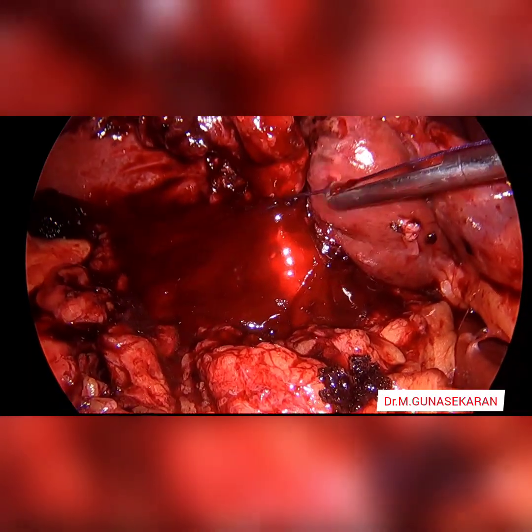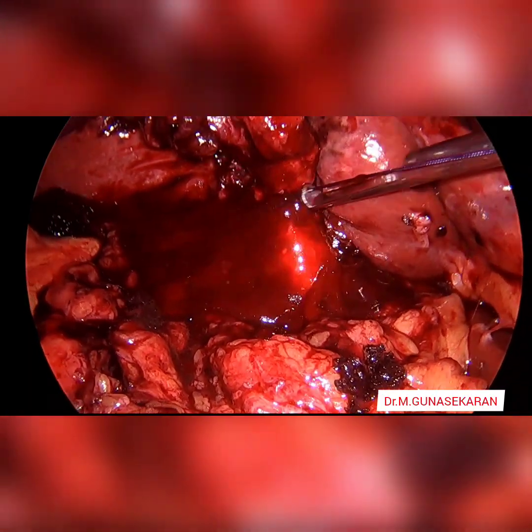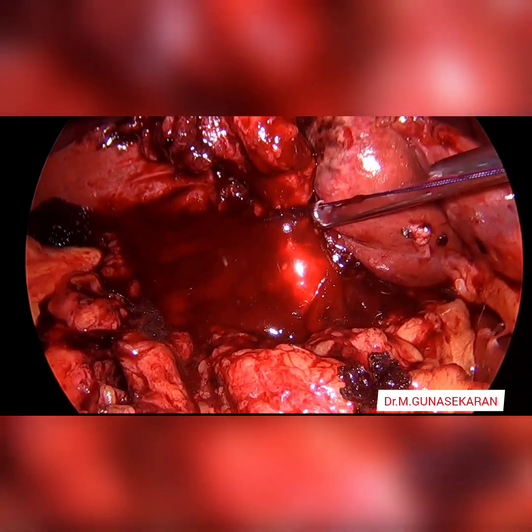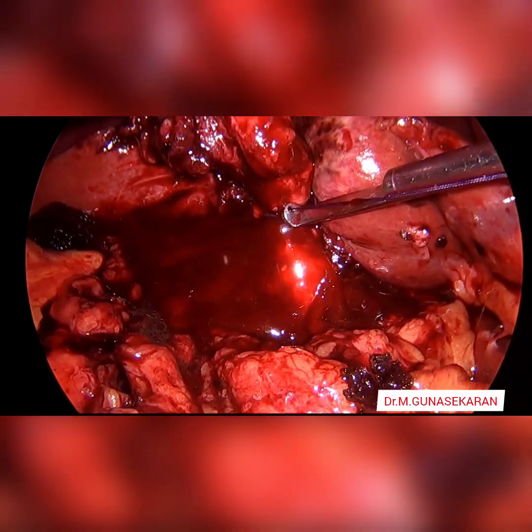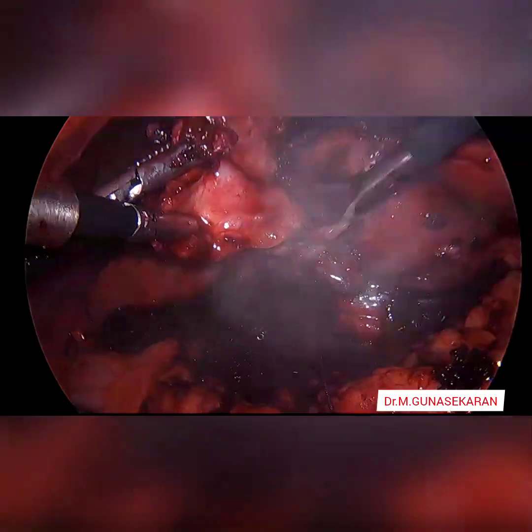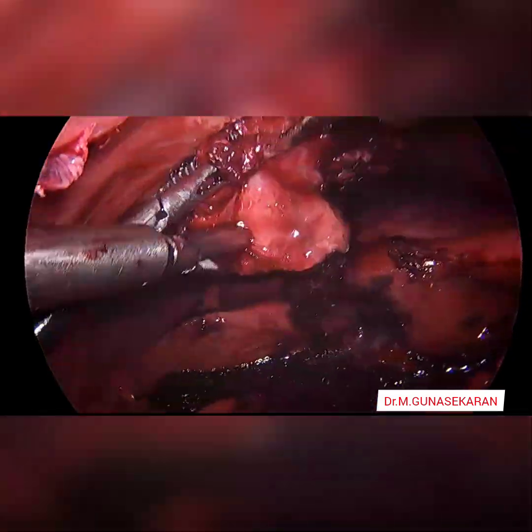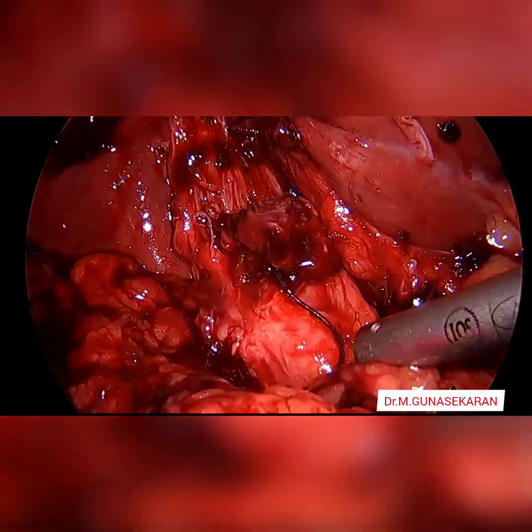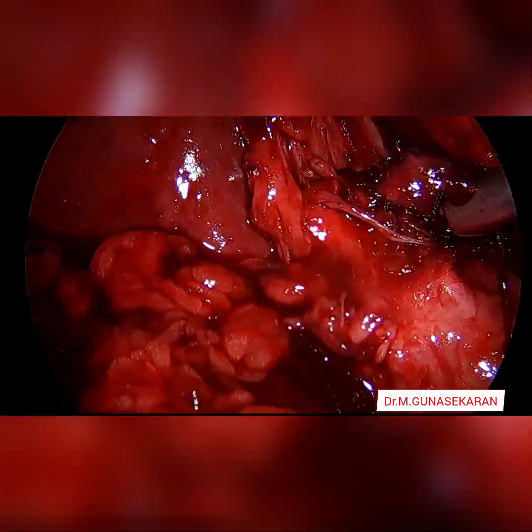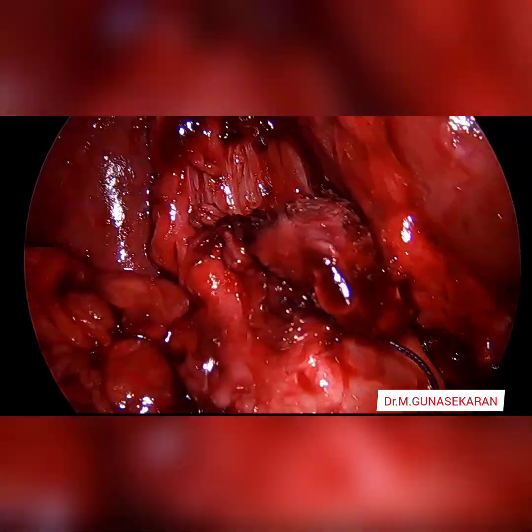Because of the dilated cystic duct, I am planning to place a loop — a micro-loop — for cystic duct occlusion. This is the post-dissection anatomy. The anatomy is now completely visualized, showing the cystic duct region clearly.